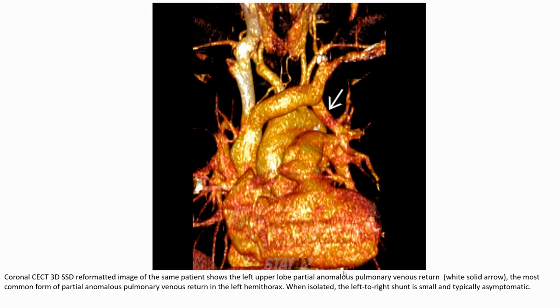Coronal contrast-enhanced CT reformatted image of the patient shows the left upper lobe pulmonary vein, widely patent, representing the most common form of partial anomalous pulmonary venous return in the left hemithorax. When isolated, the left-to-right shunt is small and the patient is typically asymptomatic.